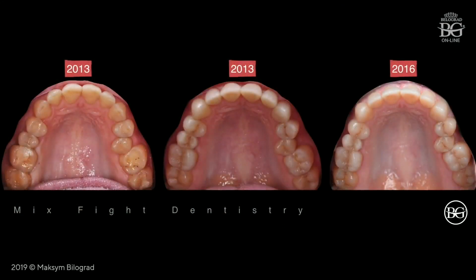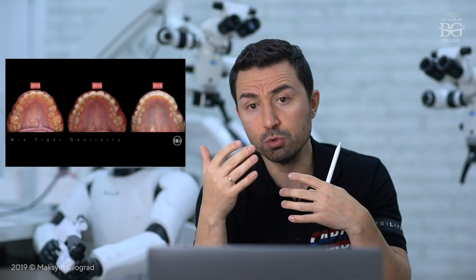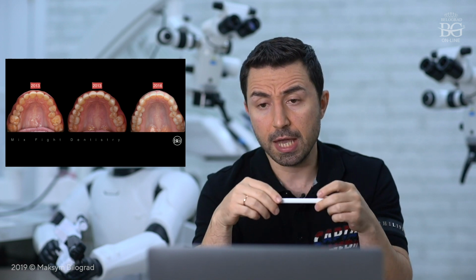But what is really good from this technique is that, as I mentioned, it is minimally invasive, it is more or less predictable, it is feasible because if you make any mistake, you can remove this composite in an easy way and redo. You can make some adjustments, you can make some corrections, okay, and you can do that type of treatment in a really short run. So I can tell you that the whole process of treatment took me 3 days after I got the wax up. During 1 day I restored posterior teeth of the upper jaw, and then I restored the lower jaw, then I restored frontal teeth, made some occlusal adjustments, polishing, and the case was actually finished.